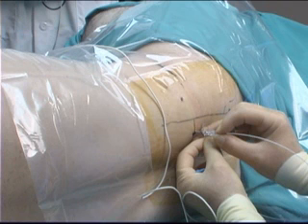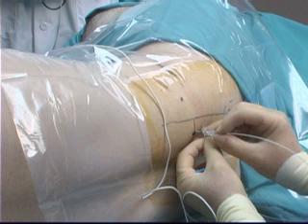Carefully withdraw the catheter tip to inside the needle shaft again. Make a slight adjustment to the needle, such as turning it 1/4 turn clockwise or counterclockwise, or advancing or withdrawing it slightly, and advance the catheter again. Repeat this maneuver until brisk motor twitches in the quadriceps muscles are observed during catheter advancement. The needle should never be manipulated if the broad black mark on the catheter is not totally visible, which indicates that the catheter is fully inside the needle shaft.